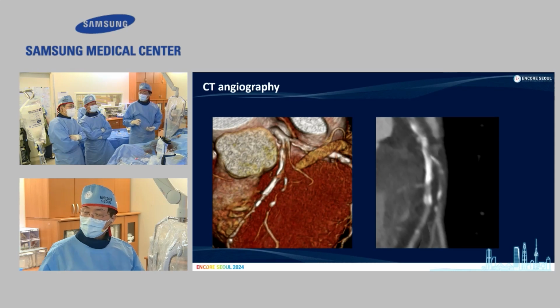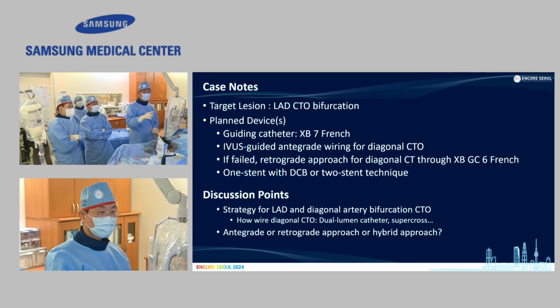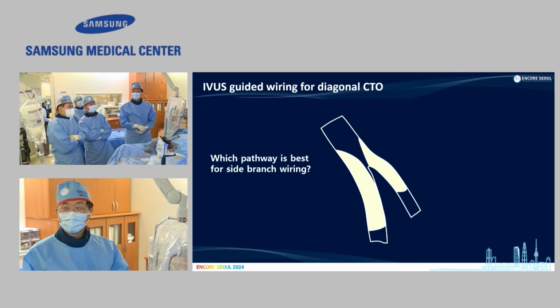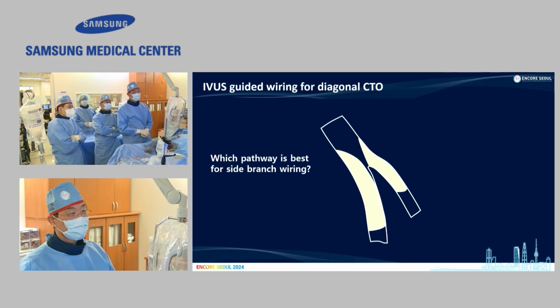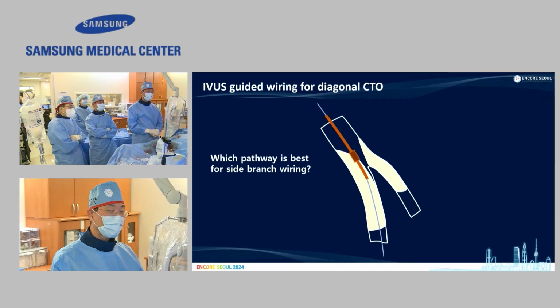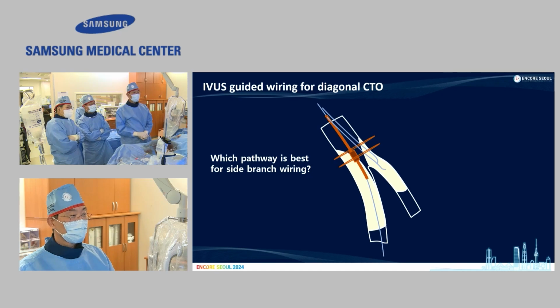So another question, last slide, please. Next. Yeah, I drew this picture myself. I hope you like it. Very good. Probably the diagonal ostium has no stump at all. I think most likely. Next. So we did an IVUS-guided approach. Next. The problem is where we can try first.